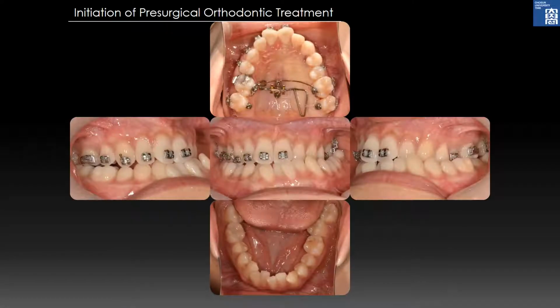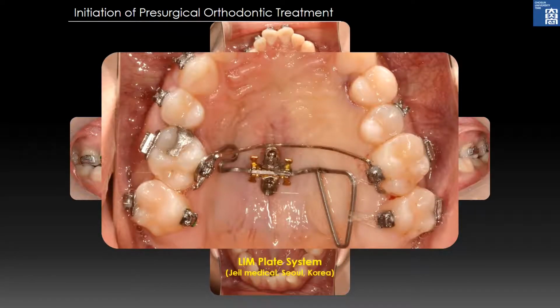After placing palatal mini implants and connecting plate, 0.032 by 0.032 inch TMA palatal lever was inserted in the bracket slot on the connecting plate with the green line configuration, and by squeezing the palatal lever on the right side, like the blue line configuration, buccal expansion force was generated on the right first molar.